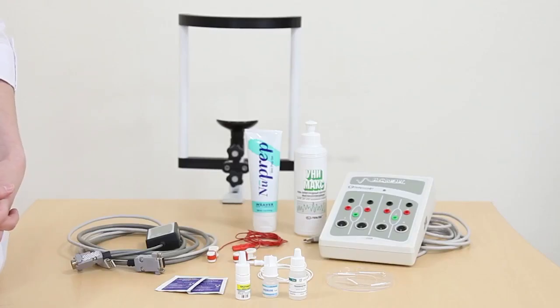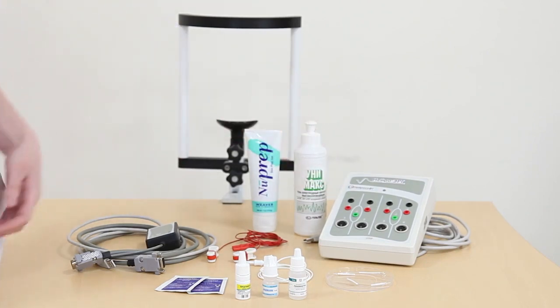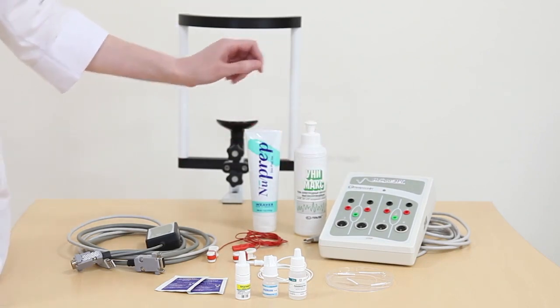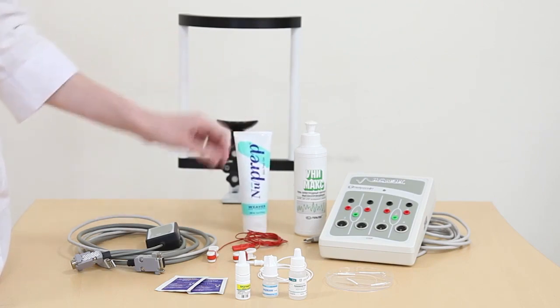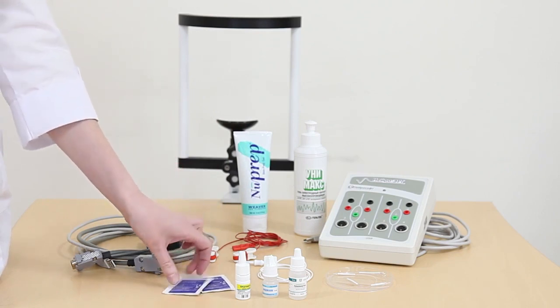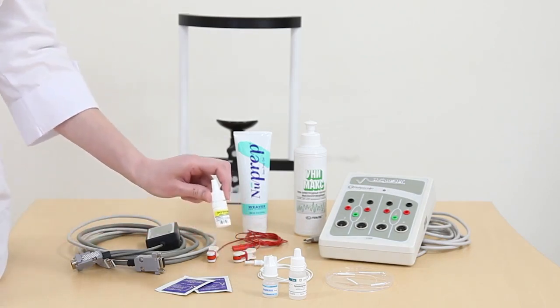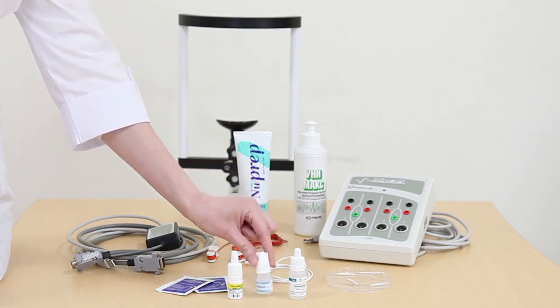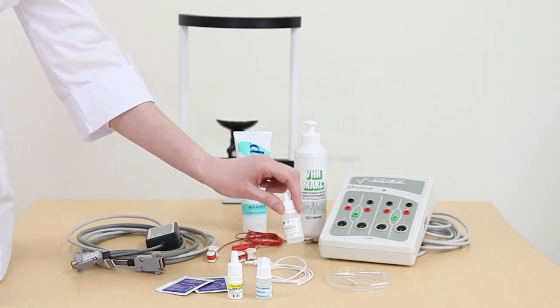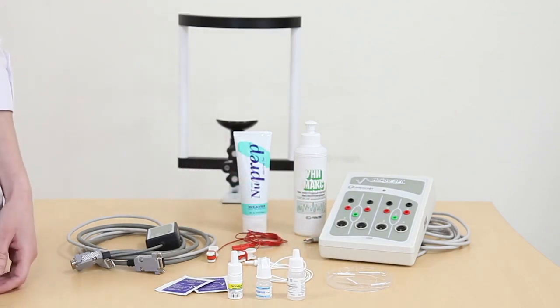So, what do we need today to make a test? First of all, the ERG system itself. To prepare the patient's skin, we should have the abrasive paste and also alcohol wipes. To prepare the patient's eye, we should use mydriatic eye drops and topical anesthetic drops. Upon the procedure completion, we shall use the antibacterial drops to ensure the conjunctival prophylaxis.